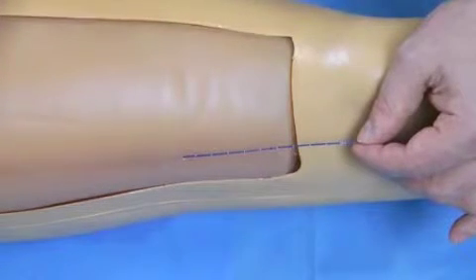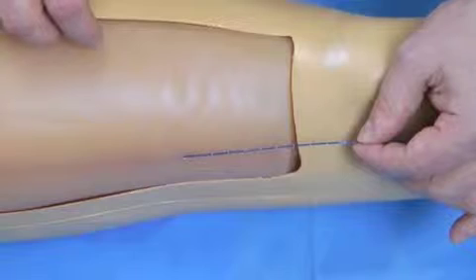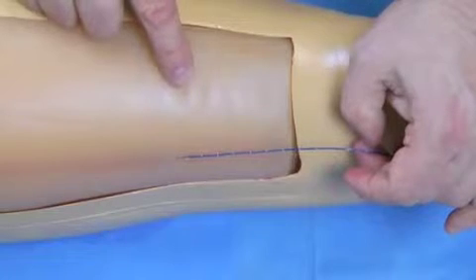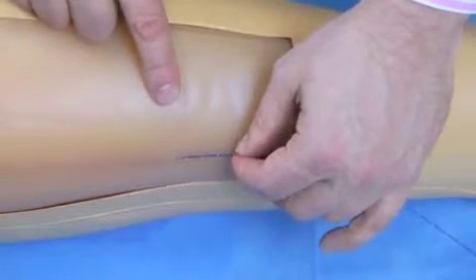At this stage, we would then put tumescence all around the fibre, and once again, this would be under ultrasound control, and the patient would be placed in the head-down position. Once the tumescence is safely around the vein, and we're happy with the top position, we can start our pullback with the laser on.